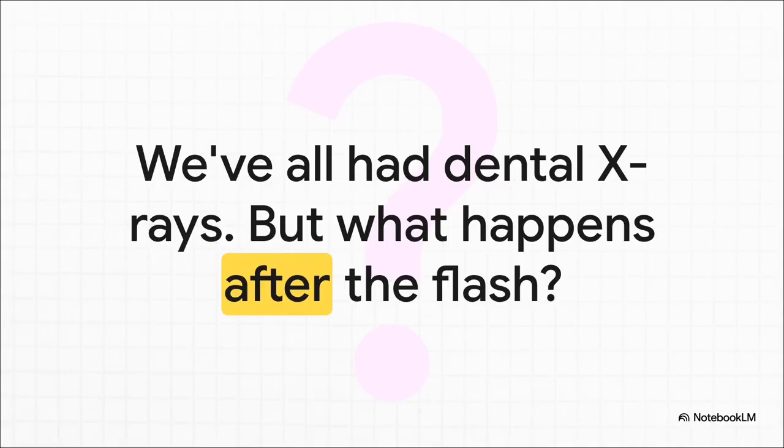Yeah, we've all been there, right? Sitting in that chair, you hear that little whirring sound, then that quick flash. But have you ever stopped to think, what is that flash? What happens in that split second? And where does that X-ray actually go?